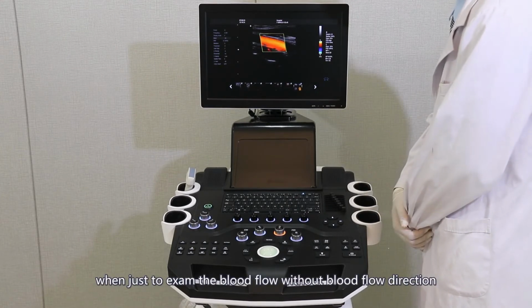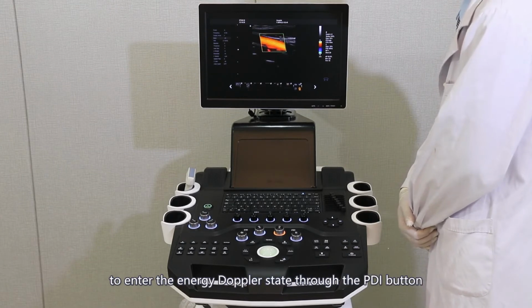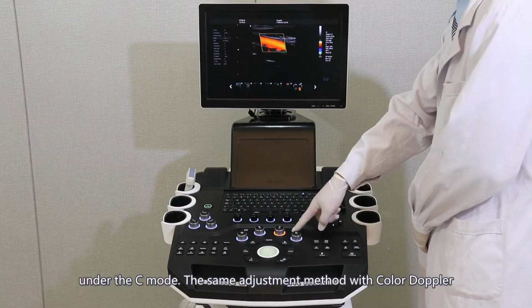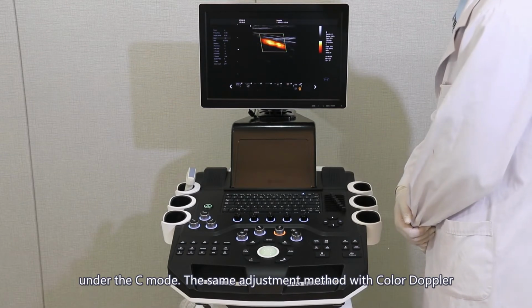When just examining the blood flow without flow direction, enter the energy Doppler state through the PDI button under the C mode. The adjustment method is the same as color Doppler.